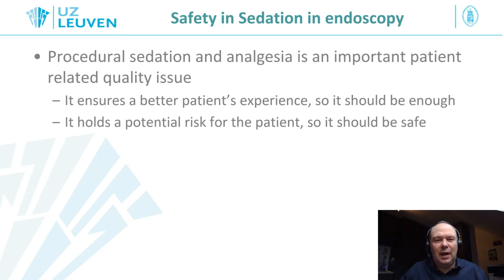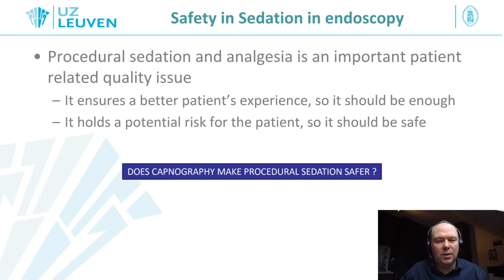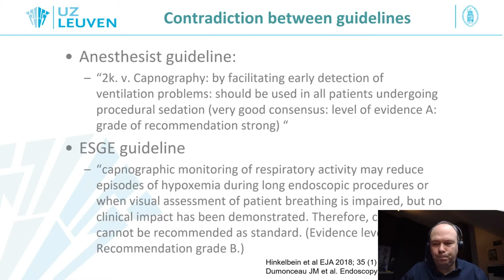Procedural sedation and analgesia is an important patient-related quality issue. Why is it important? Well, for patient experience, we should make sure that the sedation is enough. On the other hand, there is an inherent risk of causing harm to the patient, so it should also be safe. So the topic of this talk is to answer the question whether capnography is necessary to monitor the patient during sedation and can make procedural sedation safer.